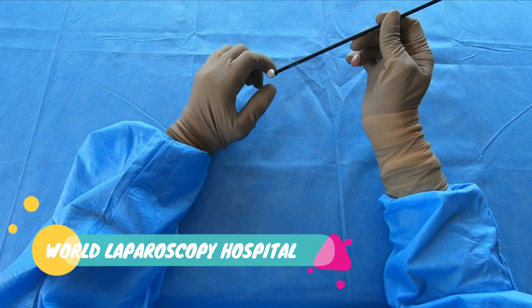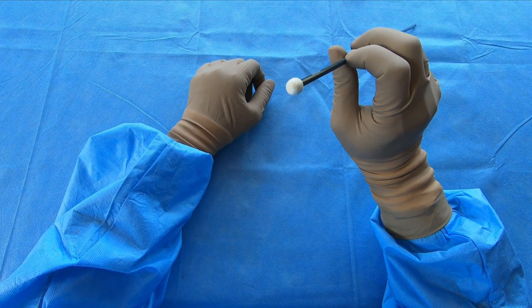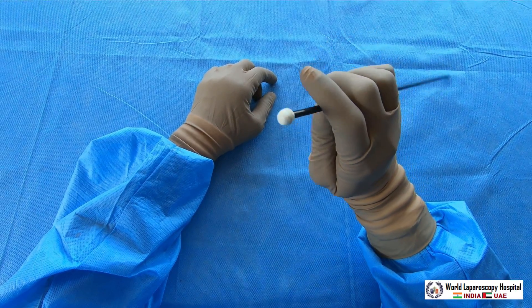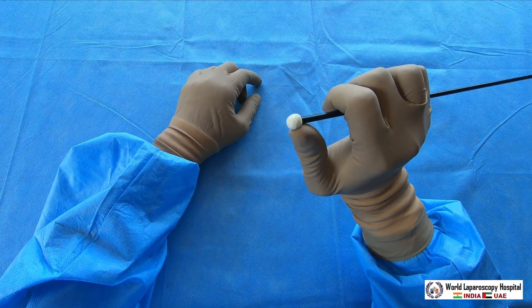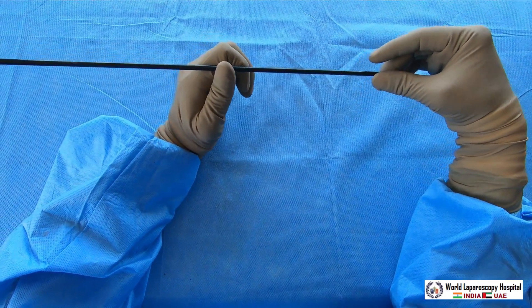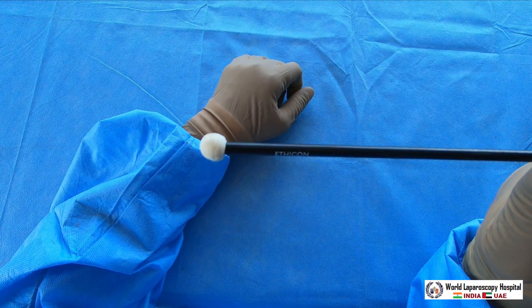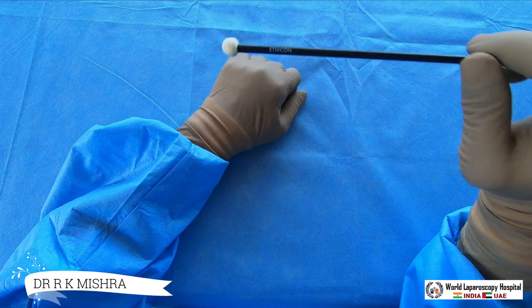Hello friend, today I am going to demonstrate a very simple but very useful instrument. This is called a peanut dissector, or pledget. It is available and manufactured by the Ethicon company — you can see it is written here on the instrument.